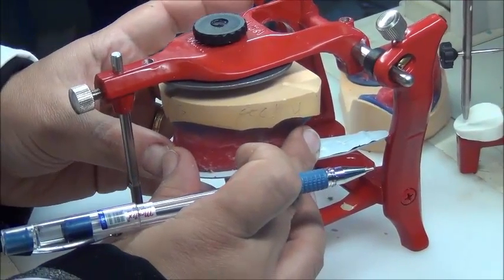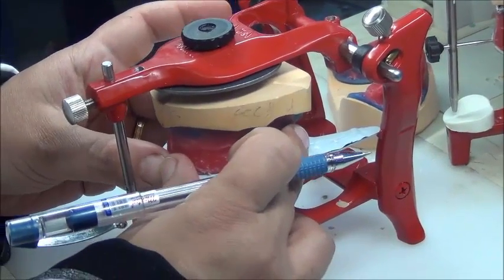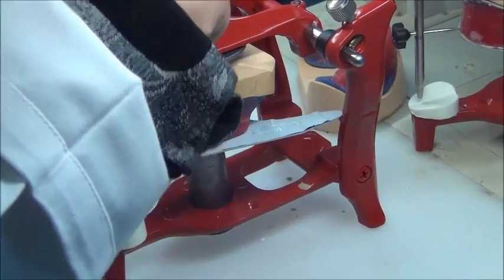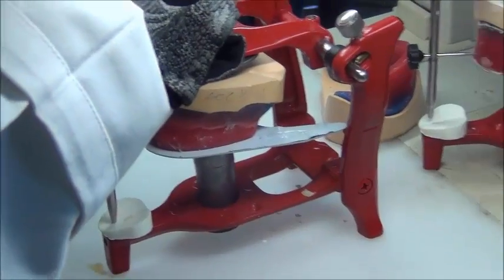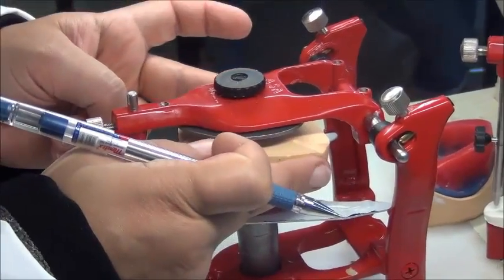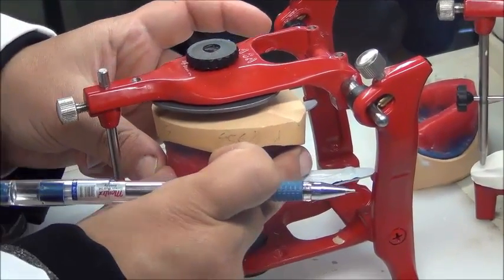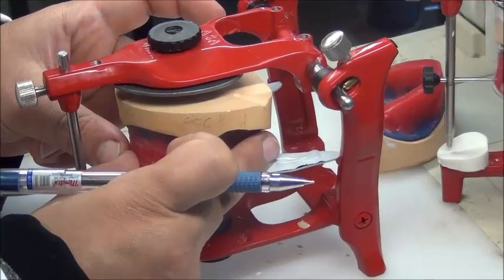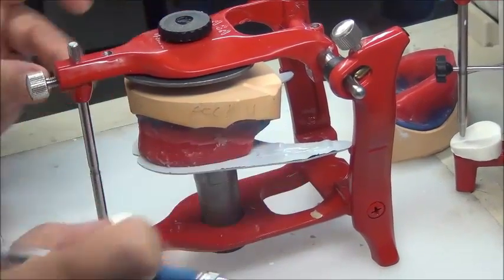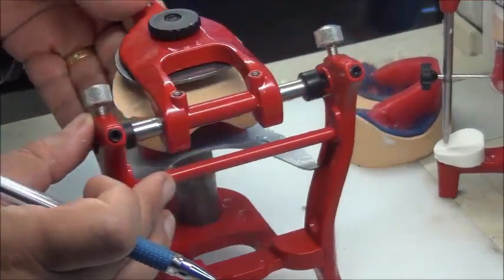Then after judging the midline, we're going to judge the posterior edge of the cast. We want to make sure that when we're looking down on your cast from up, down, the distance between this side and this side is the same. Okay? It's not shifted to the left or right. So this is our second reference for the upper. I could also look at the upper from behind.